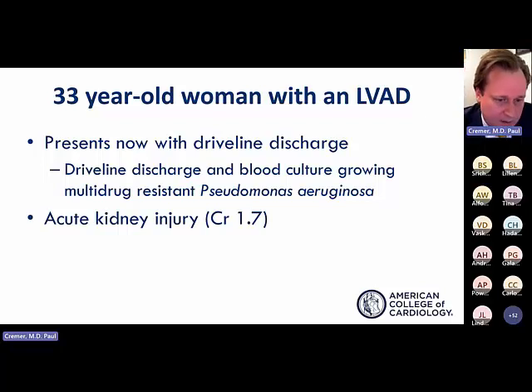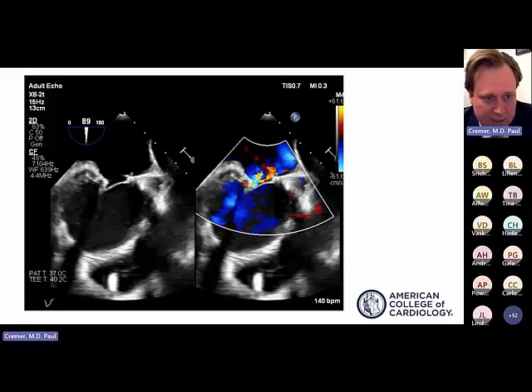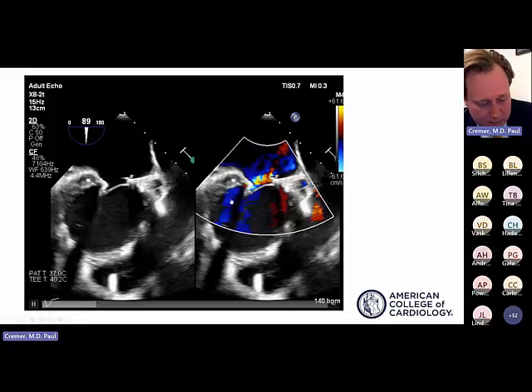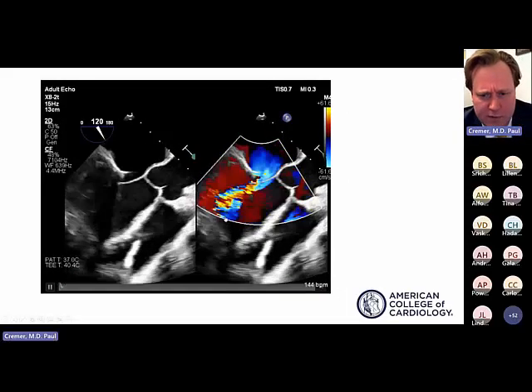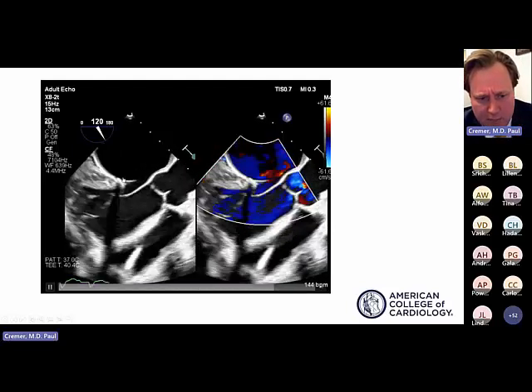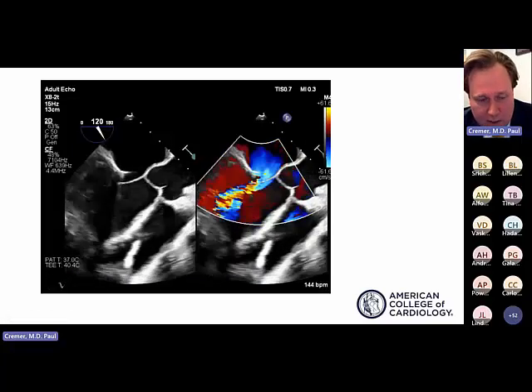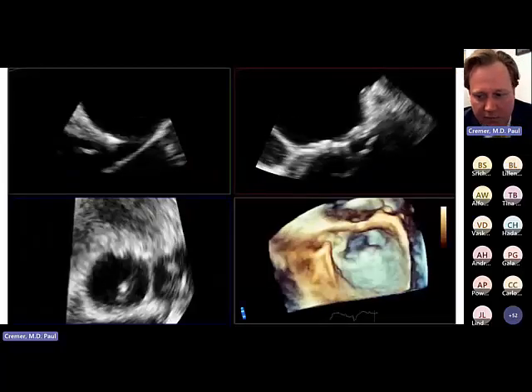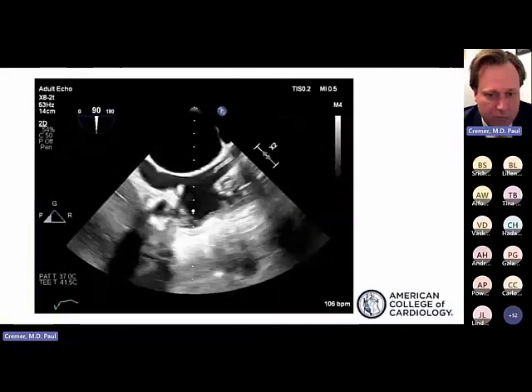I think it's been emphasized in the earlier talks that we start with echocardiography. Here's a representative transesophageal echo, mid-esophageal view at 90 degrees, and you can see this mitral valve ring here. There's really just mild mitral regurgitation. And here on the long axis view, you can see the mitral valve ring and the anterior mitral valve leaflet. There are no apparent independently mobile echo densities associated with the mitral or the aortic valves. And here's a 3D multiplanar reconstruction of the mitral valve as well.